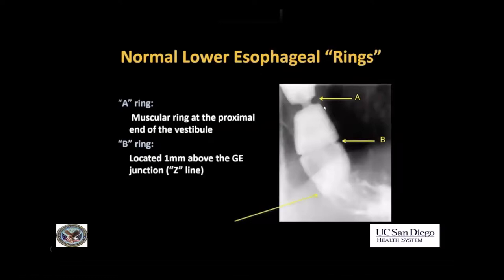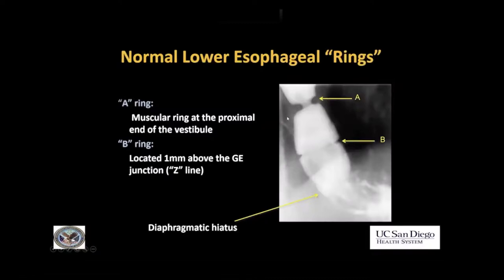Let's look at the lower esophagus. There are two normal muscular rings in the lower esophagus. The first one is the A-ring, which you often don't see — you only see it when the esophagus is very well extended. So this is unusual to see it quite as well as this, but this is where it is; it's a normal anatomical structure. The space in between the A and the B-ring is called the vestibule. The B-ring is located right at the GE junction, just a millimeter above the histological GE junction, which is called the Z-line.